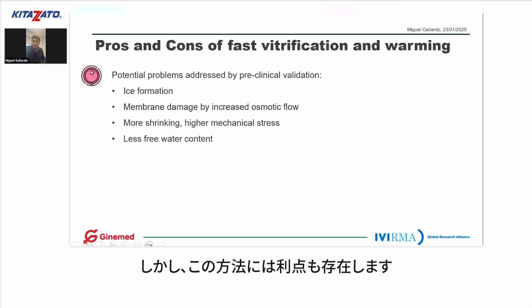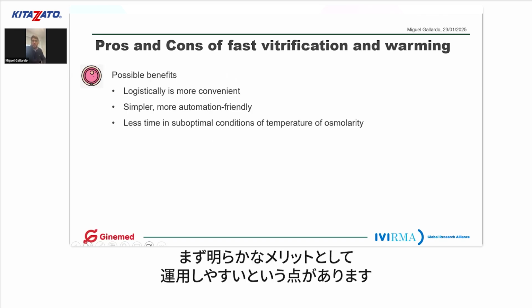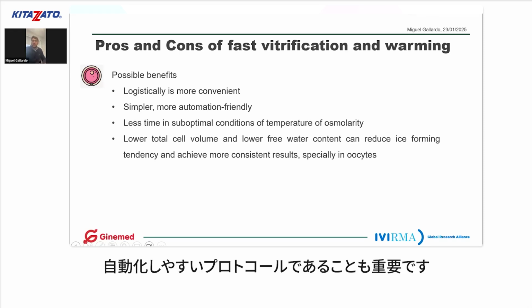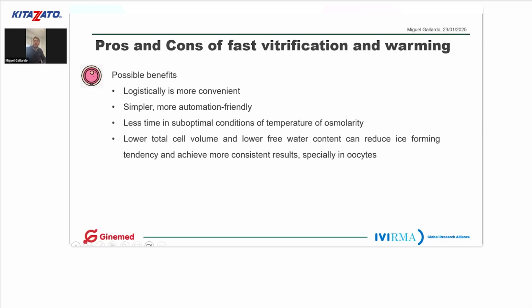potential benefits as well. I want to finish on a positive note because, of course, it's very obvious for everybody that logistically it will be more convenient, but it's also a simpler protocol. Less manipulation, it's more automation friendly, which is coming in the future. We have to think about the oocyte as well.